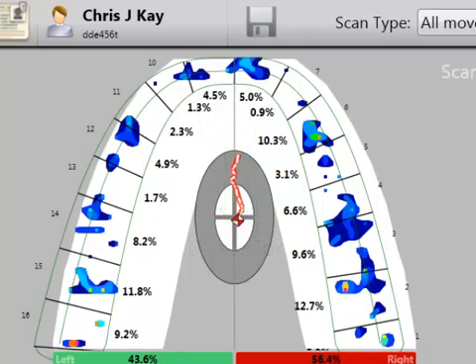In this example, the teeth are loaded evenly on both sides, causing the center of force to move along the midline.